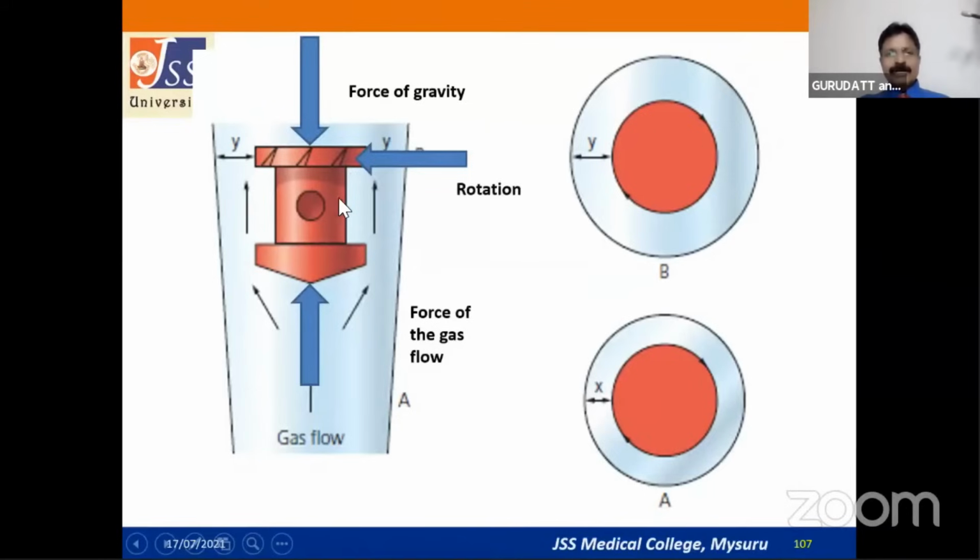So one more white dot will be there over the bobbin. This is a fluorescent dot. Suppose I'm using the machine in darker areas, especially in radiological suits, you can just see this fluorescent dot, and you know whether the flow is occurring or not, whether the bobbin is rotating or not. So these are some of the minor things which can be asked in the exam. So you should always know about the fluorescent dot that is there.